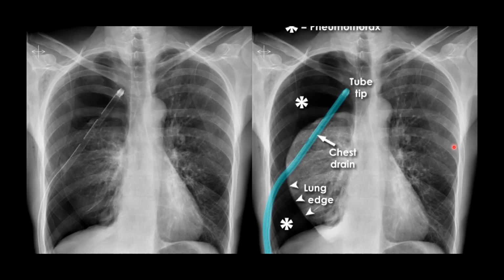So here are some chest x-rays. I loved this one because it actually showed me a little bit more definition. Here on the left is what you're going to typically see on a pneumo, and this is a large pneumo, okay? If you look closely, you're going to see this margin. See that nice margin that goes up and around? That's the lung. This is the whole lung, right? You can see it right there. All that black space, look, there's nothing. It's all clear. That's your pneumothorax.